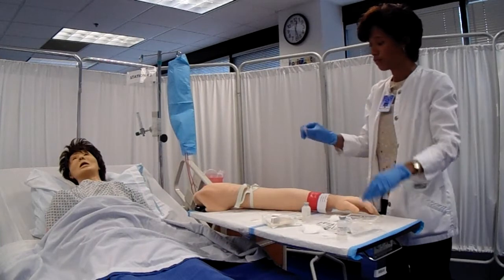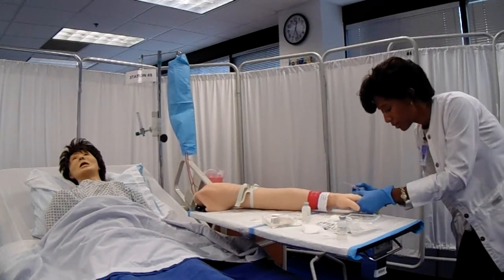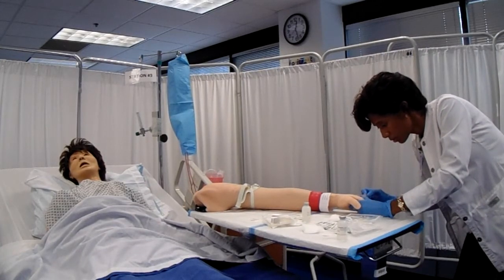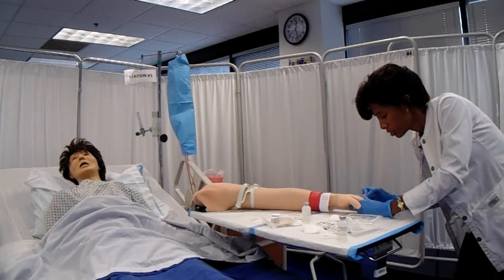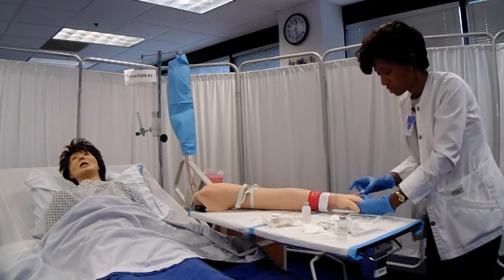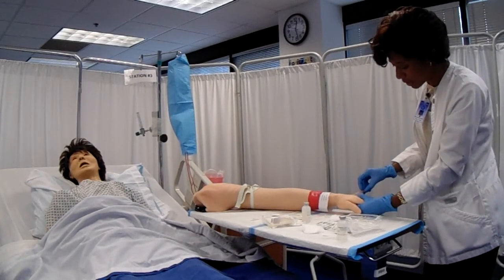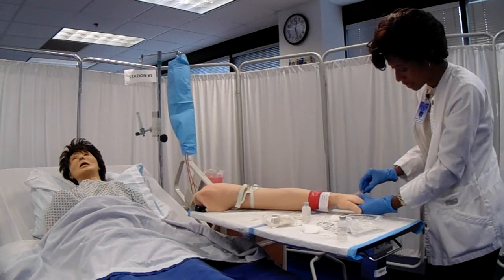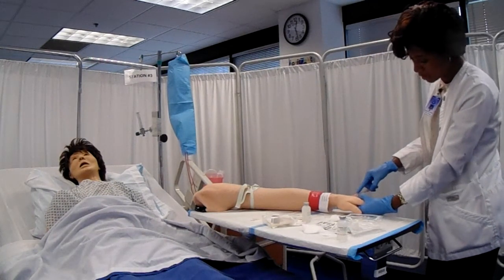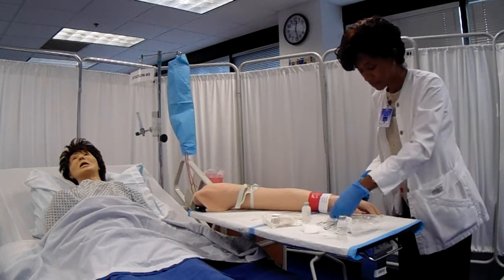Okay, I'm removing the cap from my catheter, and with the bevel up, I'm pulling the skin taut, and you're going to feel a little pinch. Okay, I've inserted my catheter almost halfway. I've watched for blood return. At this point, I'm going to go ahead and extend the catheter with my forefinger all the way and pull back on the needle until I hear the safety latch snap in place.